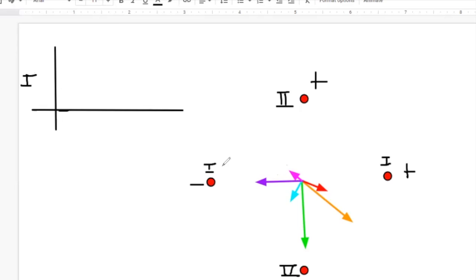If we draw our imaginary lead vector, with a tail here and a head here, and we take the dot product between this vector and the red vector, it's going to be a positive number. Or to think about that another way, if we project this vector onto the black lead vector, it's going to give us a positive magnitude. Everybody clear on that? Very important. So it's going to be some sort of positive value in the beginning.